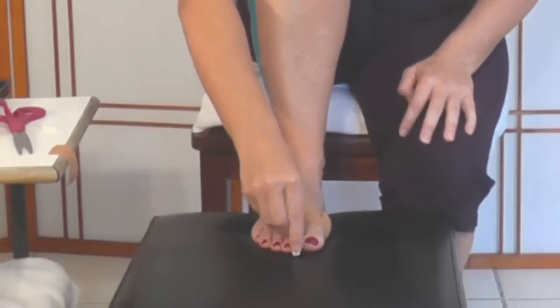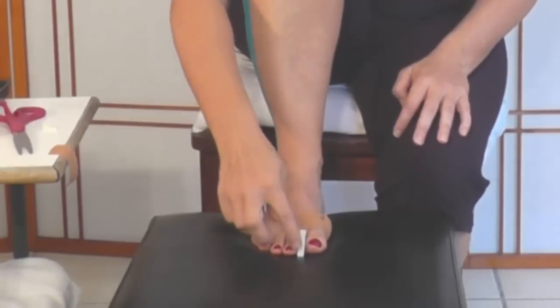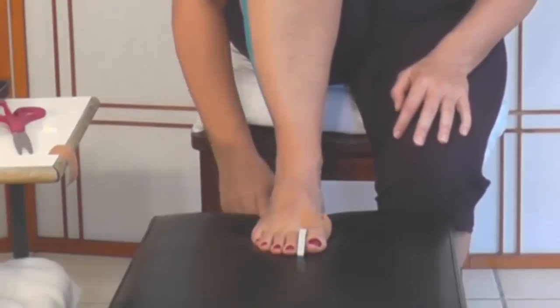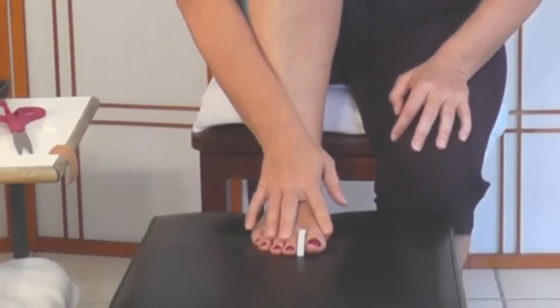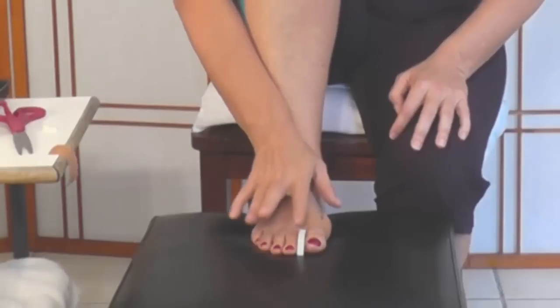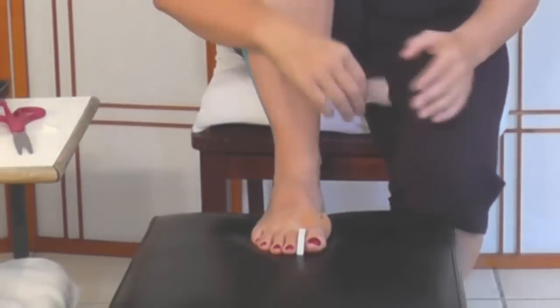When you're putting them on — if I had a bunion here — I'd want to do it the length of the toe. I did a pretty good job of trimming, though I might trim a little bit more off the edge. You never want to tape the two toes together because that just feeds into the problem, so you'll want to tape the spacer to the affected toe.